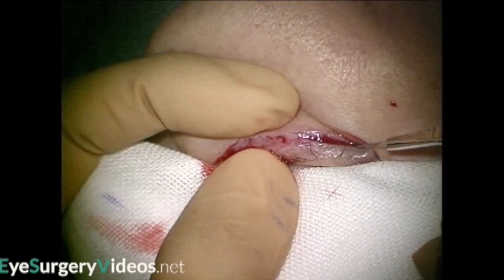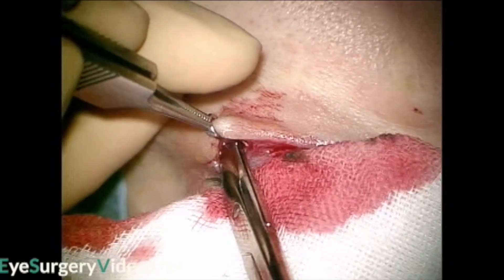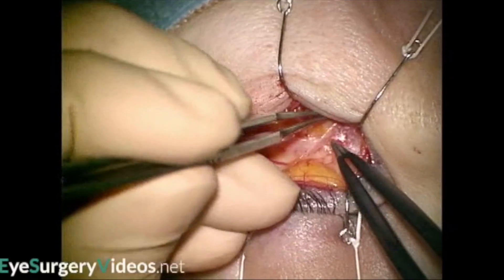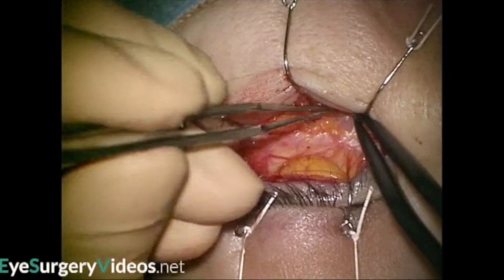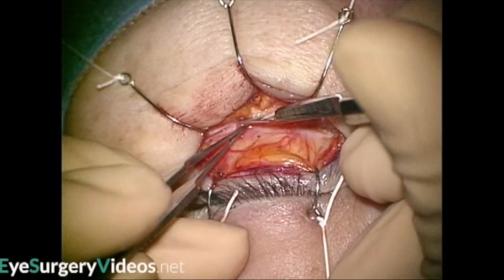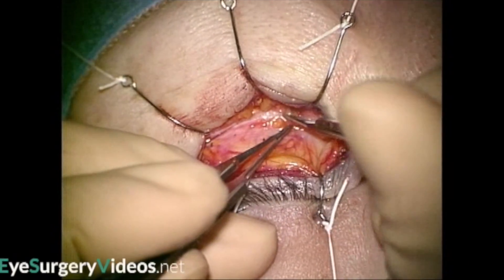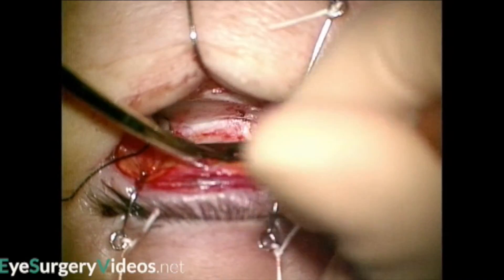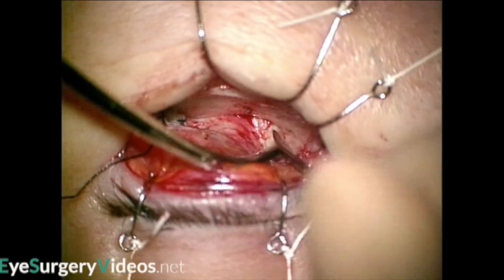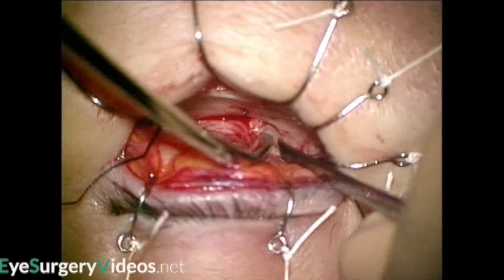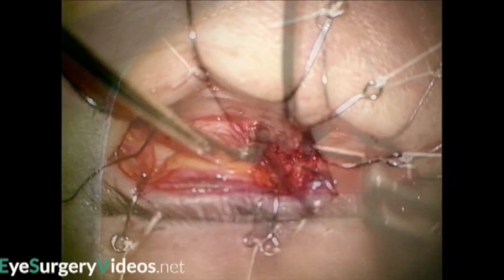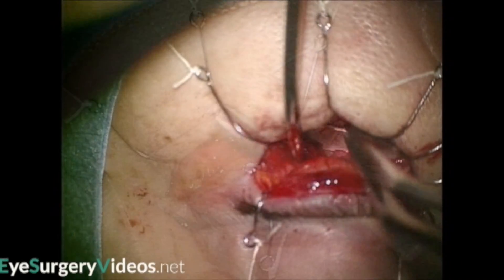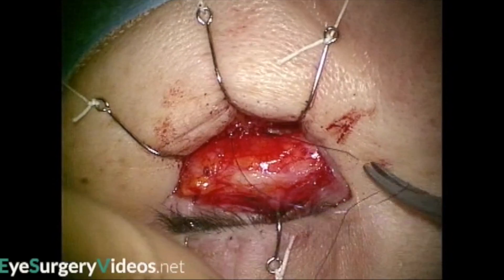A subciliary skin incision is made, extending from the inferior punctum at approximately 15mm towards the lateral canthus. Skin, orbicularis and septum are all transected. The periosteum is then incised at the point of the inferior orbital rim, in this case with a scalpel, and then gently elevated. In this case a search is made for an orbital floor fracture. A titanium plate is then placed at the fracture site. Periosteum, orbicularis and skin are then closed sequentially.